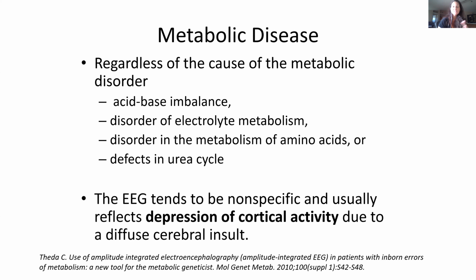So these metabolic situations are causing just an overall sick brain, which causes this overall depression of activity, much matching the presentation of the baby, right? So if you think about these metabolic babies as they present, if they're undiagnosed or late diagnosis in that first week of life, they begin to come in and they're just floppy and they're encephalopathic, and they're almost always just really that low activity. So this depression of cortical activity goes along perfectly with that.